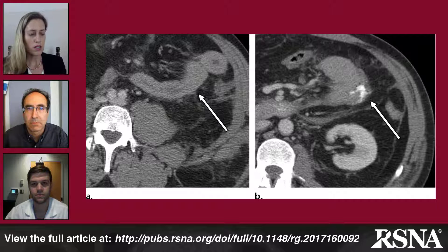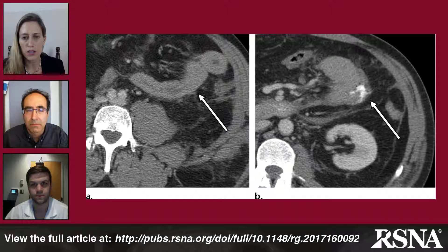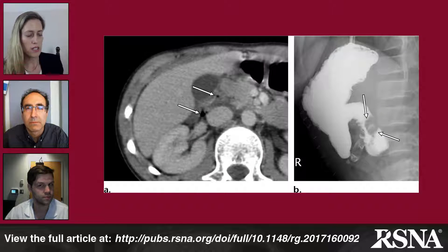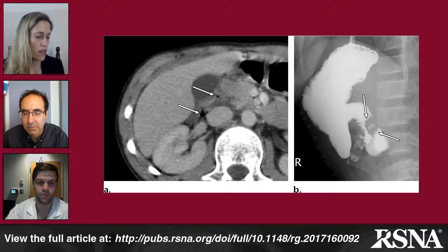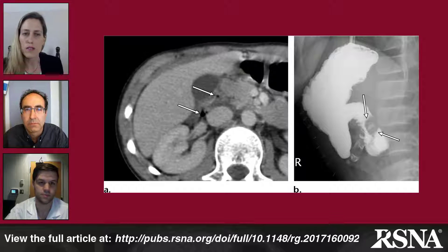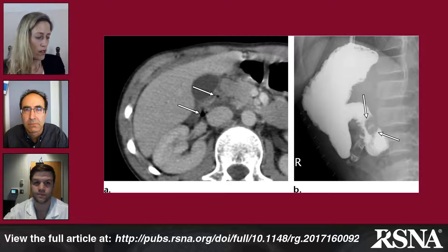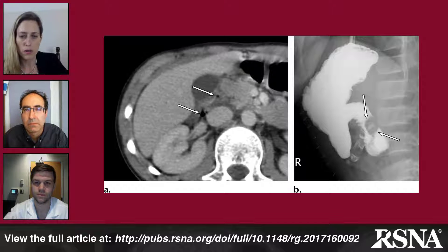Although we do not commonly administer oral contrast in CT for trauma, it is used to troubleshoot problematic bowel loops where we suspect a bowel wall injury. Figure 3 highlights free air, which is a specific but not sensitive finding for bowel injury. In this image, a 14-year-old male sustained blunt abdominal trauma with the handlebars of his bicycle. There are two small foci of free air adjacent to the duodenum, as well as retroperitoneal fluid. The patient was brought to surgery and these findings were confirmed as duodenal perforation.